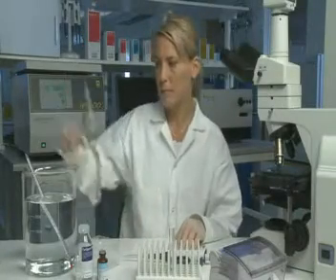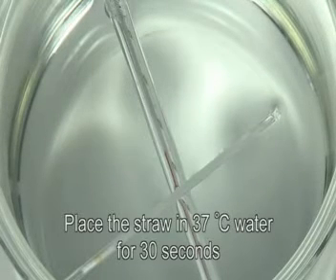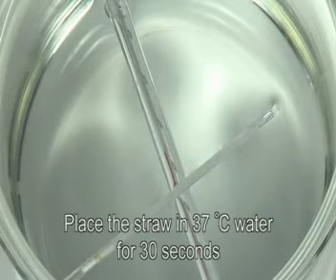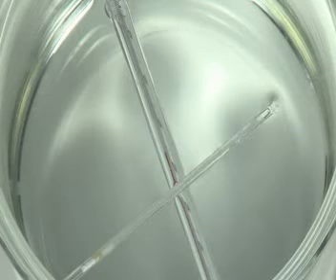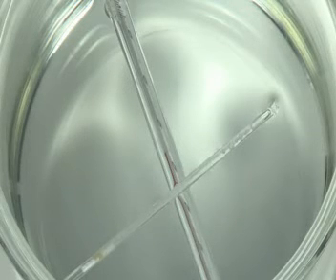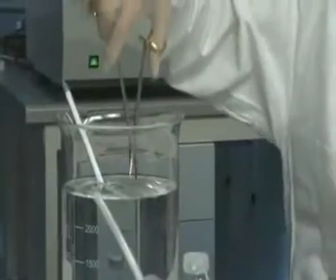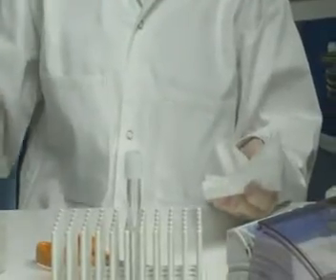Thaw in 37 degrees Celsius water for 30 seconds. Then carefully dry the straw to avoid water from contaminating the sample.